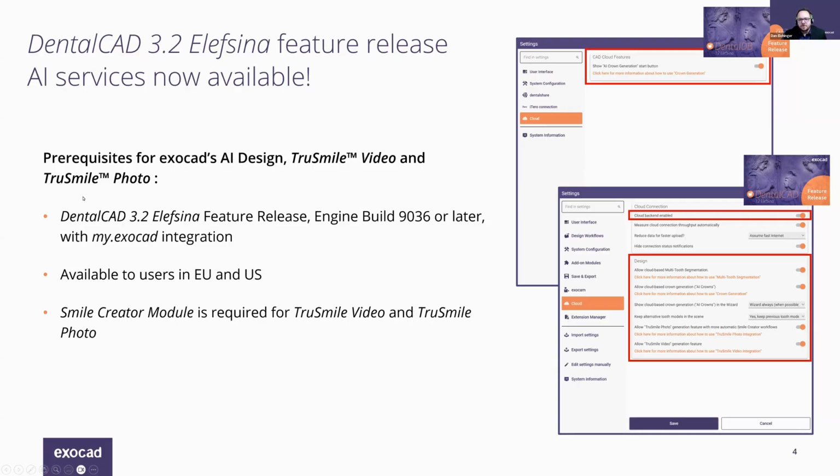These features are available to users in the European Union and the United States of America. When it comes to True Smile video and True Smile photo, we won't cover those topics today in the live demonstration, but that is required to have Smile Creator and True Smile modules.